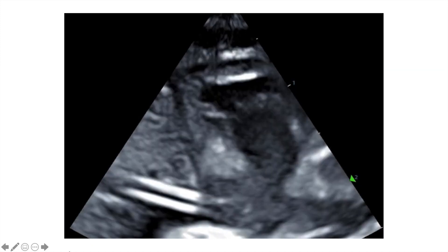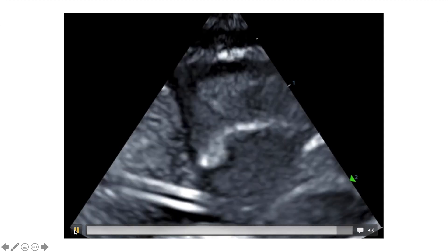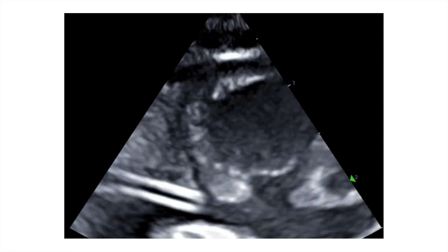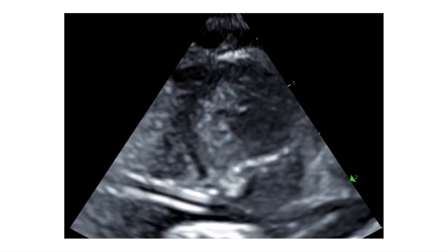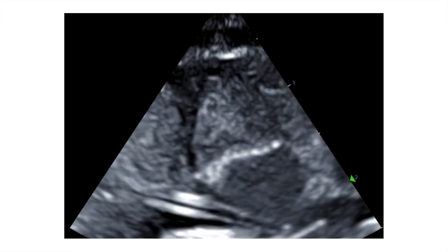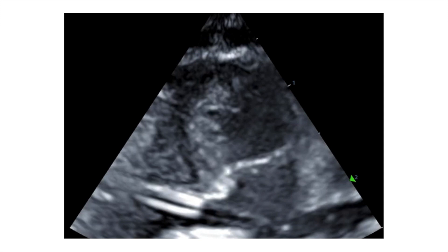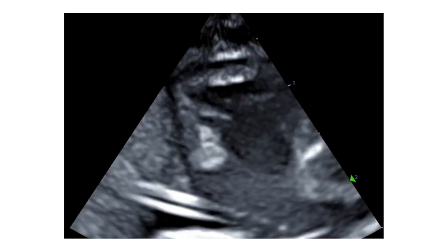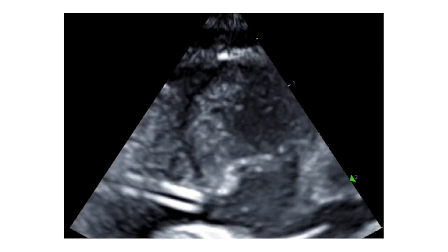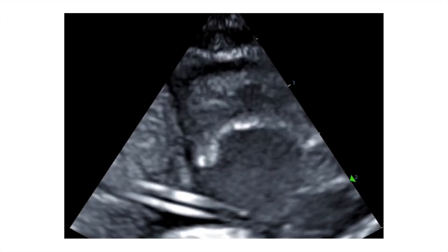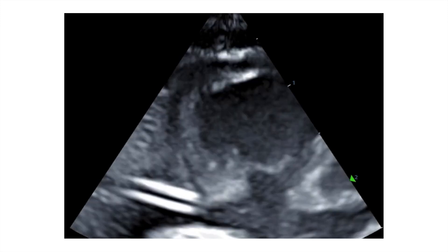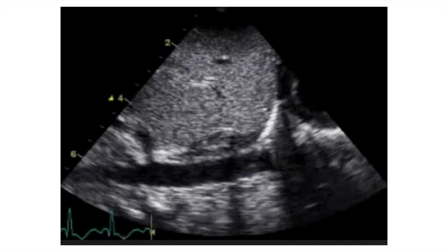Here is another baby where you can see the UVC inside the right atrium — it's pretty deep. In this case, the UVC needs to be adjusted.